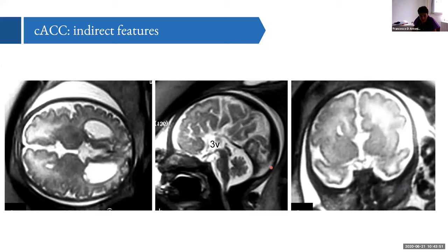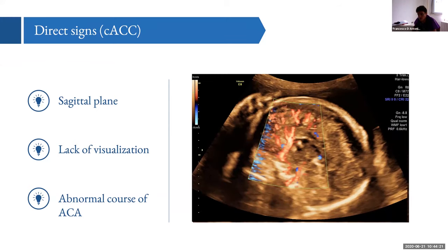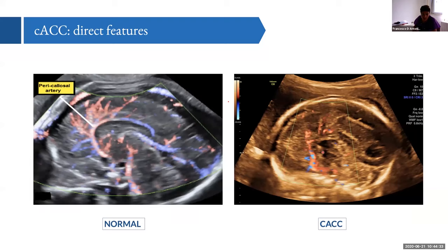Another indirect sign is the radial disposition of cerebral fissures, which is most visible on MRI. The only plane that directly confirms absent corpus callosum is the mid-sagittal plane, where the corpus callosum is not visualized and the anterior cerebral artery — instead of following the shape of the corpus callosum as the pericallosal artery — ascends directly to the calvarium. Comparing a normal case with an ACC case makes this abnormal arterial course clearly visible.